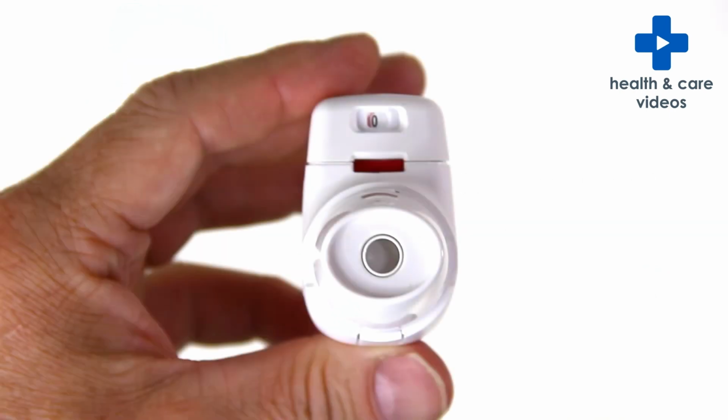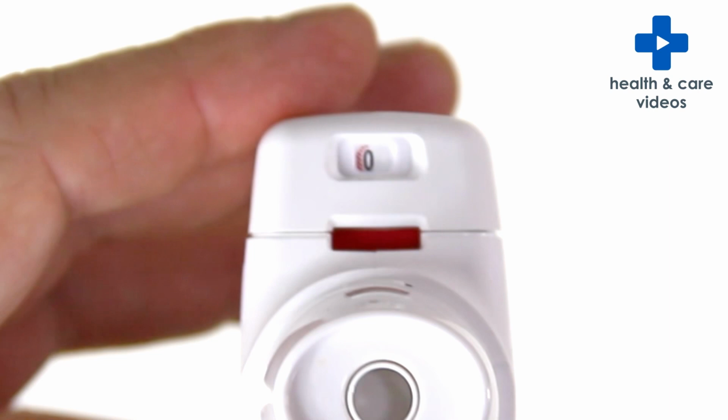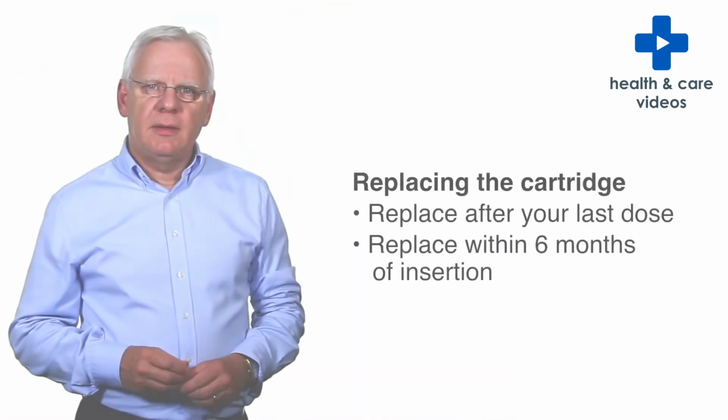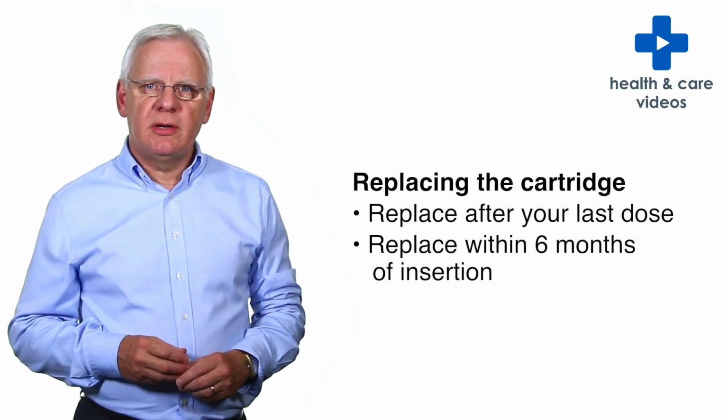There is a counter on the inhaler showing the number of doses remaining. The number decreases by intervals of 10. When a red striped band appears, this means you are nearing your last dose and you should reorder a new cartridge from your GP. After inhaling the last dose, you must insert a new cartridge.